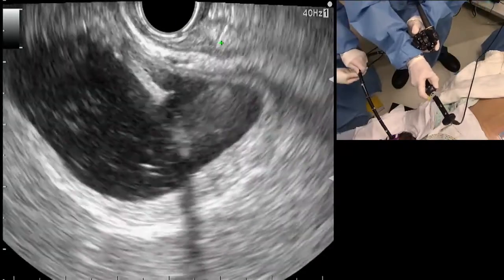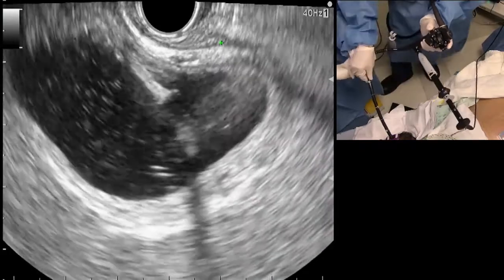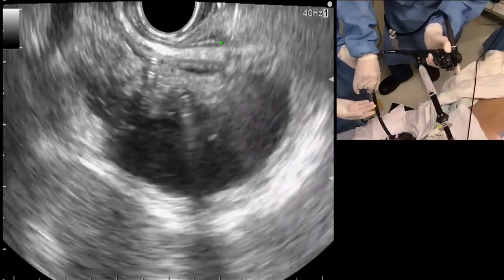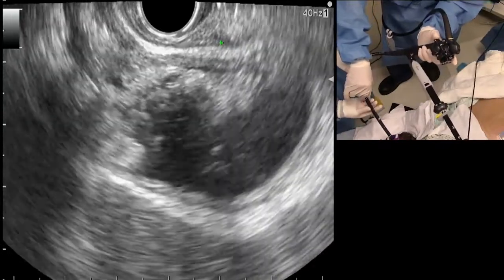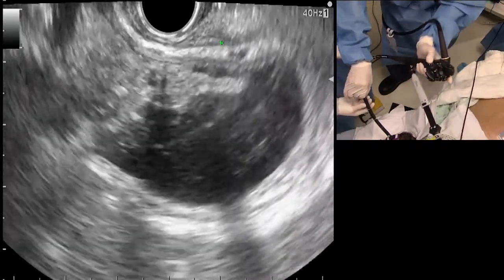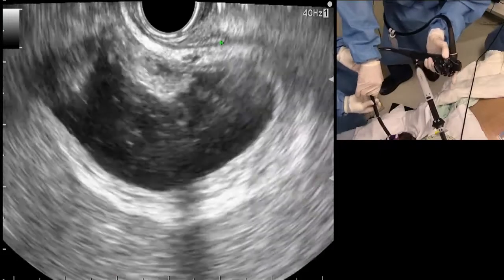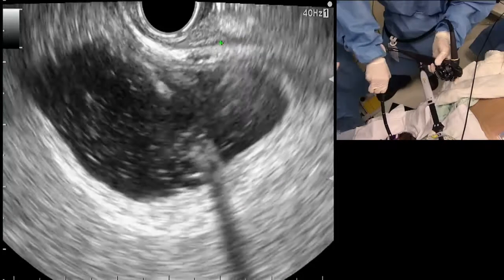And I'm moving it back and forth, right, like that. Okay. And I'm kind of close to those vessels, so I kind of want to see what I can do to get it away. Maybe this might be better. And yet I also want to have it in an area where I have the maximum runway for my sheath, right? That's not good. That's too close to the vessel, right? There are all these little things you've got to fine-tune. You don't want to be too close to the fundus. You sort of wish you could make that vessel go away.